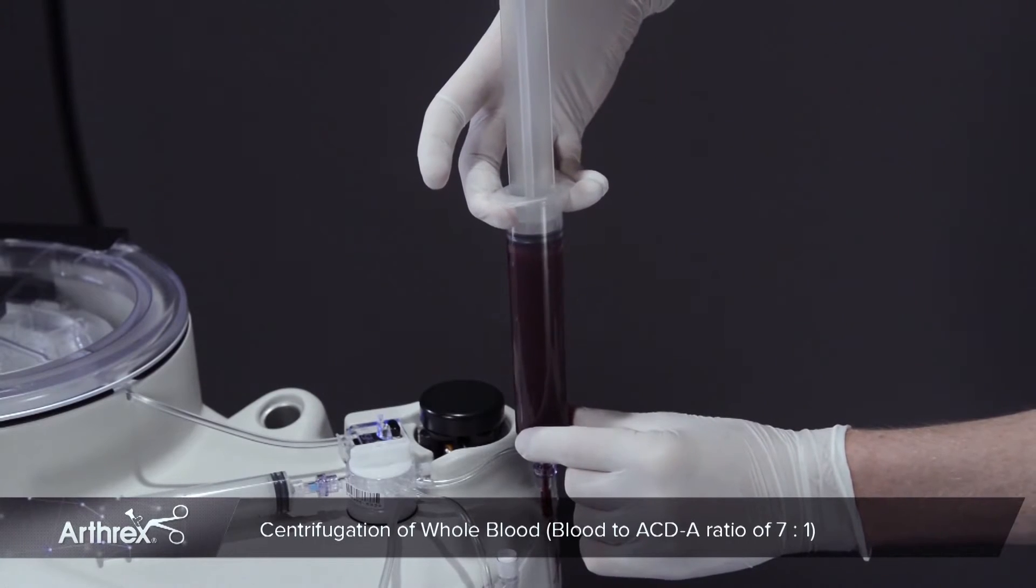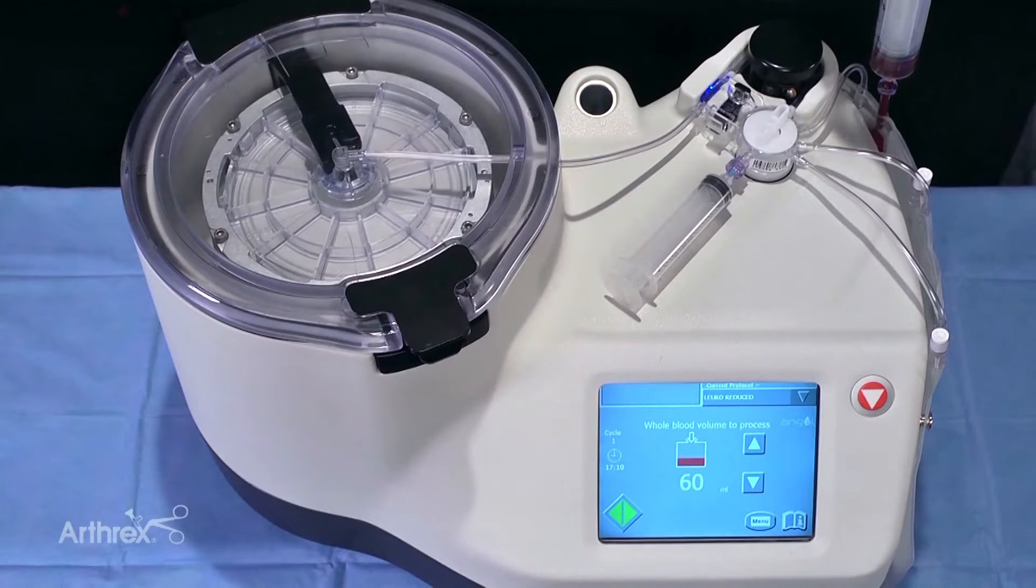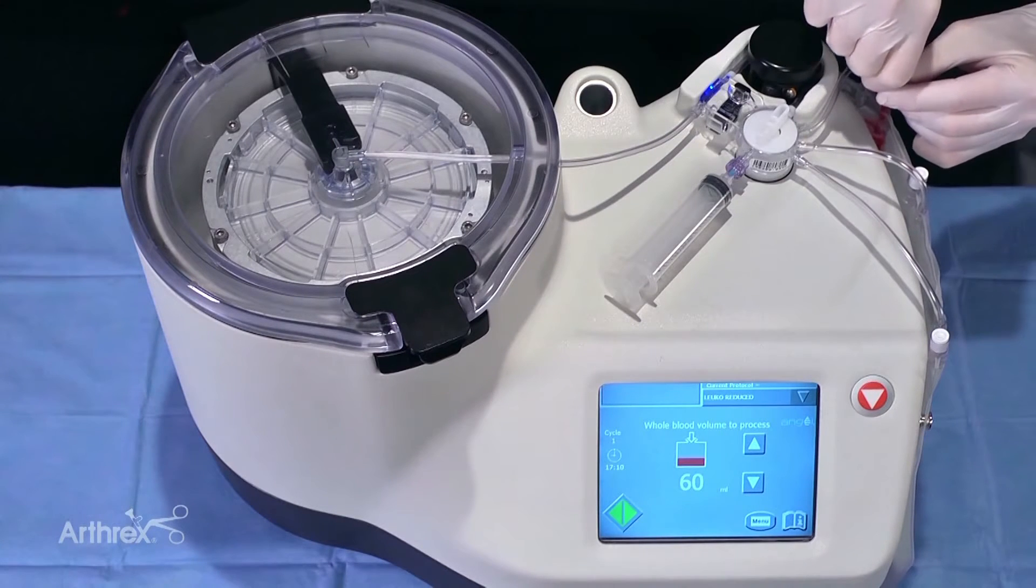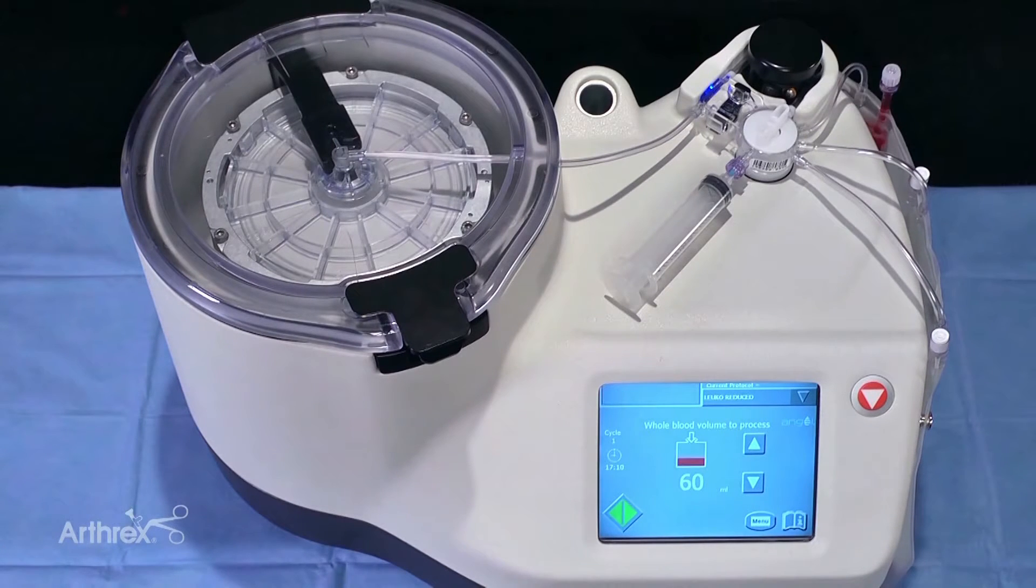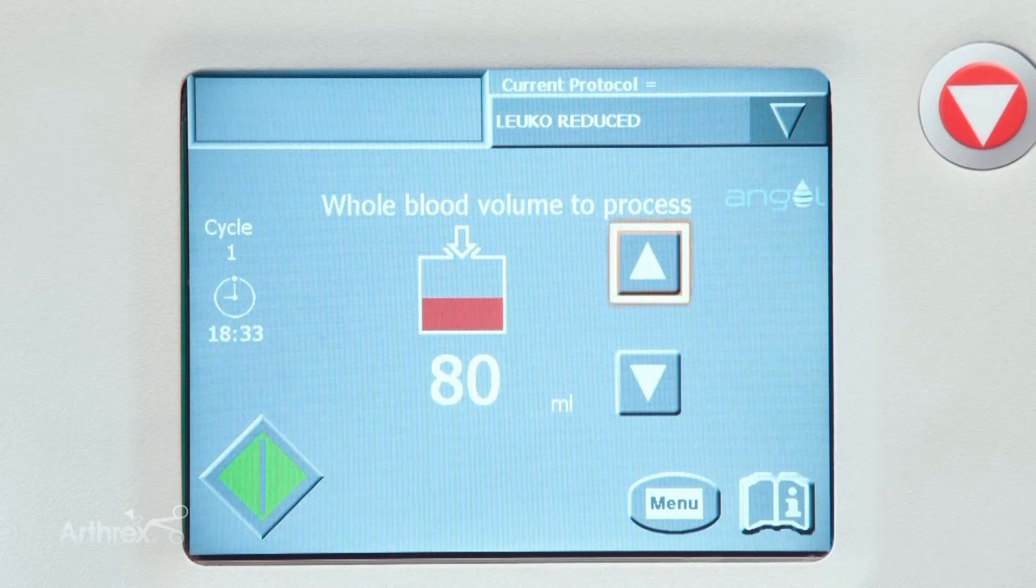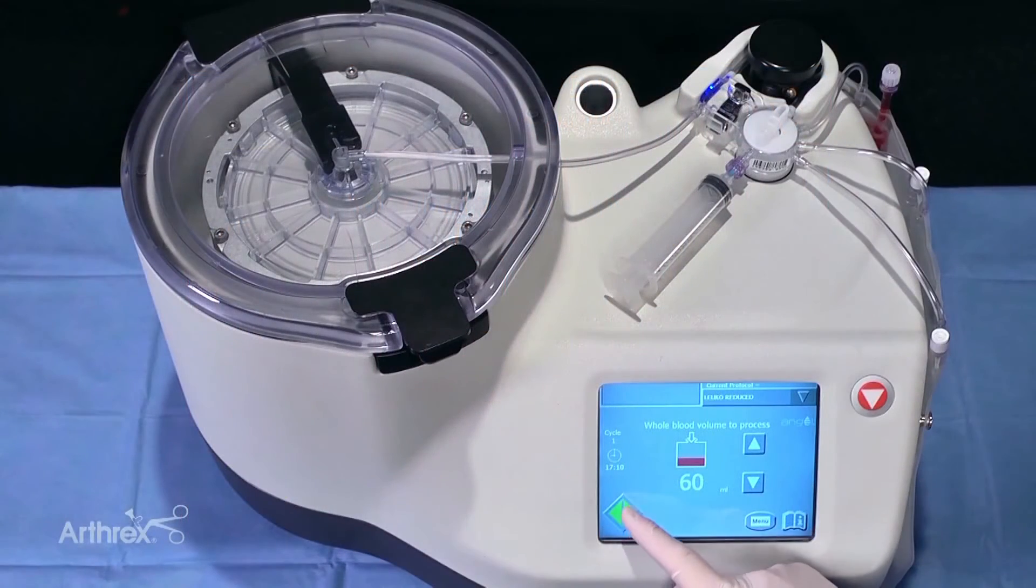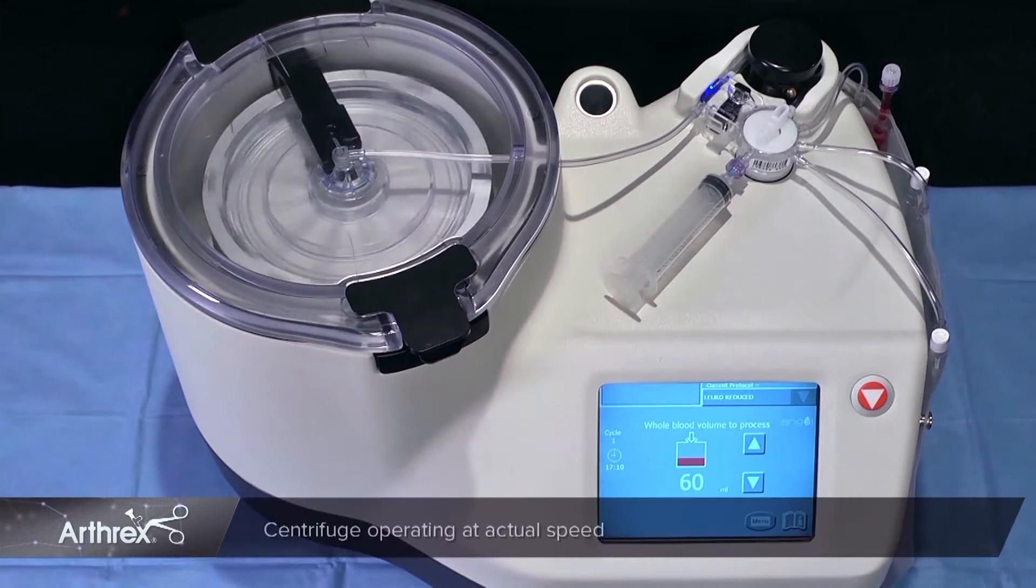To begin processing, introduce the blood sample into the whole blood end compartment and then recap the port. To process a different volume of blood, adjust accordingly with the volume arrows. Press the green start button to begin the centrifugation process.